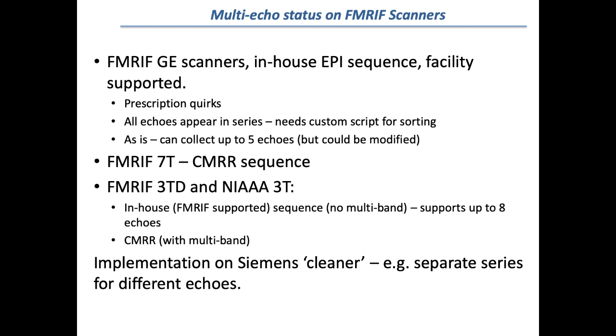To my understanding, our implementation on 3TD and the NIAAA 3T is not gating capable. I'm not sure whether the CMRR has that capability or not, but we're not able to add that capability because we don't have source code for that version of the sequence.